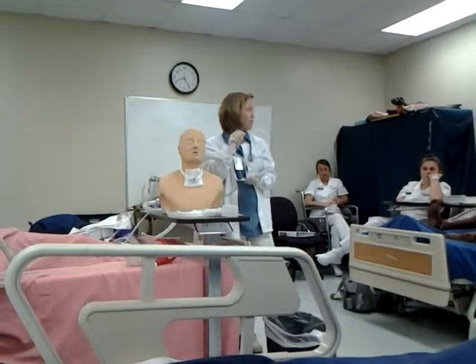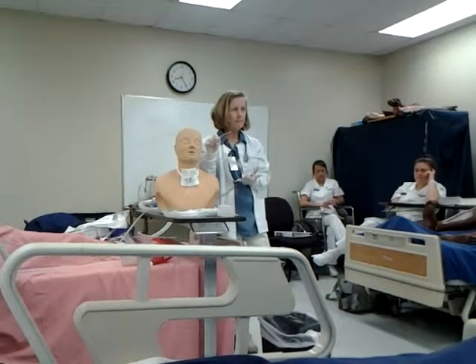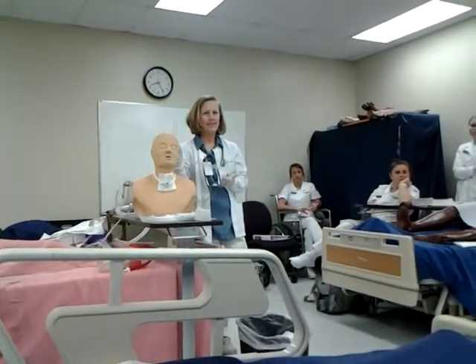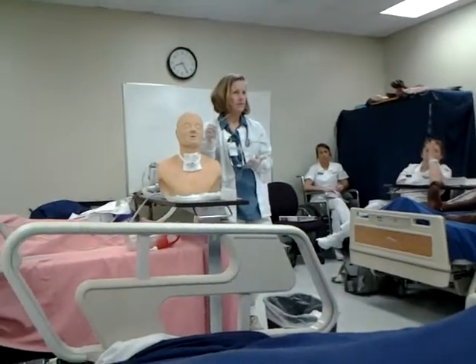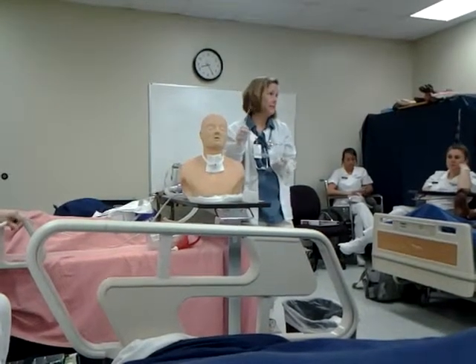They said that on the oral suction. 10 to 15 seconds. All right? Once I go down. Why is that? Why is it 10 to 15 seconds? You're taking their oxygen, because you're sucking air out, okay? Not just phlegm. You're actually sucking oxygen right out of their lungs. Okay, that makes sense, doesn't it?